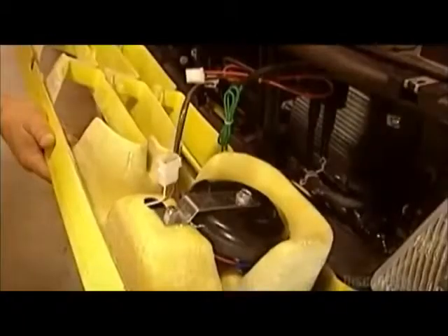Now they spray glue on the back of sheet vinyl. This highly durable antibacterial flooring goes on top of a plywood subfloor they've installed on top of the truck's aluminum floor. Now for the electrical system.